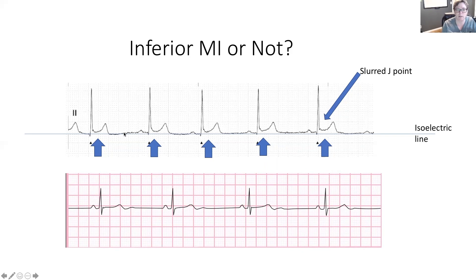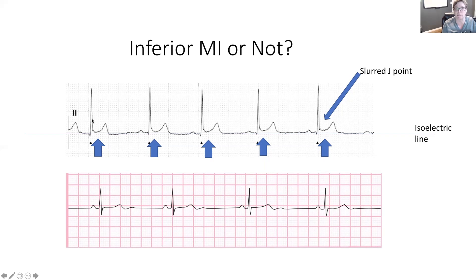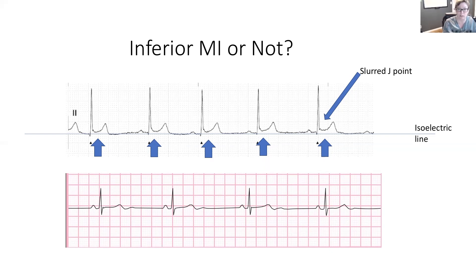We see the QRS nice and narrow, then a T wave, P wave, QRS, T wave, and we can see the P wave in the remaining rhythm. What I've pointed out here is this QRS — it usually comes down to a negative deflection, then comes back up to the isoelectric line before making the T wave. This is what we call a slurred J point. It could be a normal physiological finding in a younger adult, but if this was a 60-year-old smoker, we'd be a little more concerned. Here we have a slurring of the QRS going into the T wave, and as a result our ST segment is elevated by one box or more. This would be an ST elevation MI, question mark. The doctor looks at the full 12-lead to identify if this is a normal physiological finding or pathological.